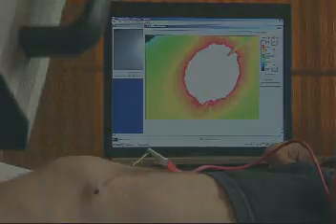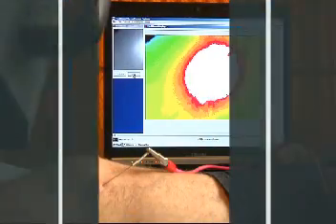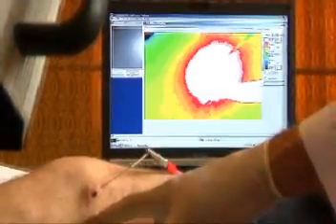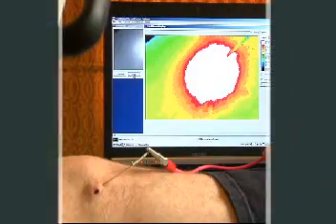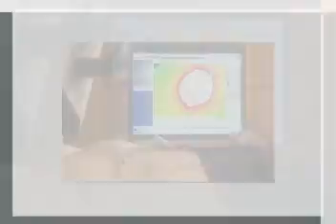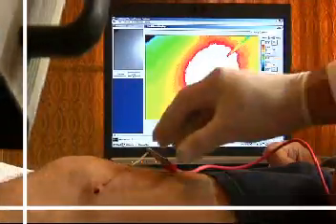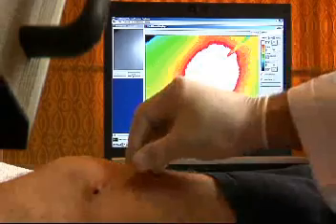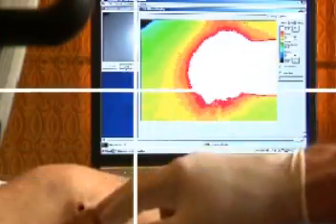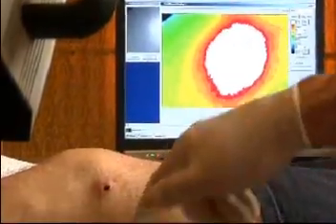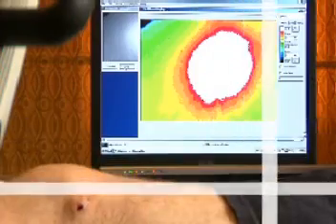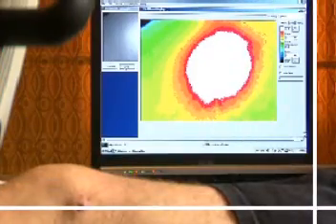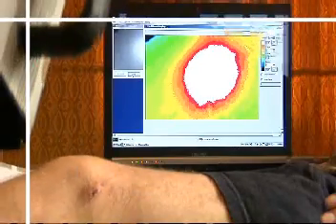We're getting ready to remove the probe. Yeah, we're a good half inch or more clear margin here. So we have the machine off. Our margins go around the tumor, which is what we wanted. And it's still killing. And then we'll just put.